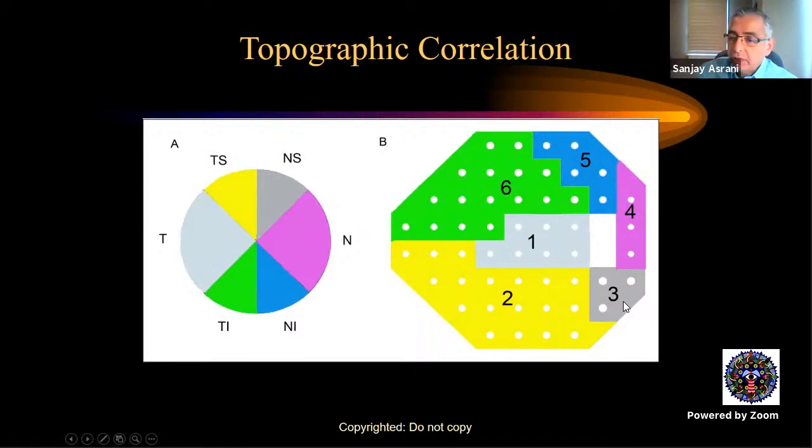While we are on this slide, I'd like to elaborate a little bit on the types of field defects that allow us to detect the kinds of glaucoma or the optic nerve pathology. So when one sees a defect right here in the extreme areas of area 2 or 6, that is nasal steps and wide arcuate losses, those are classically associated with high pressure glaucoma. Whereas if you see the defects closer to area 1 for both areas 2 and 6, that is very classic of low pressure glaucoma.